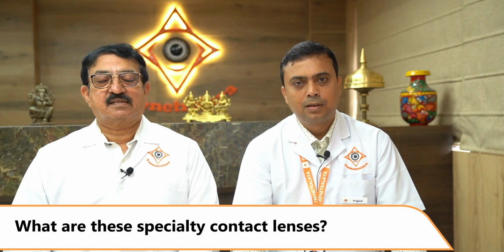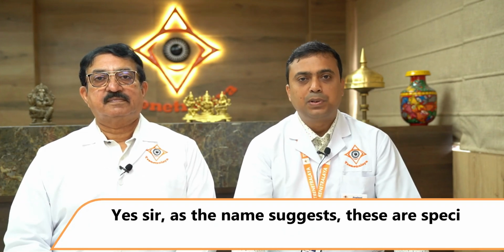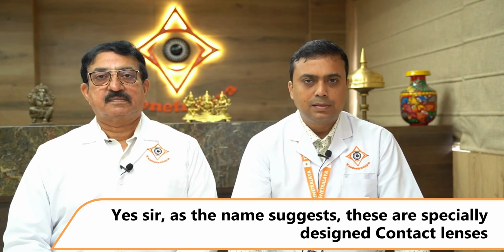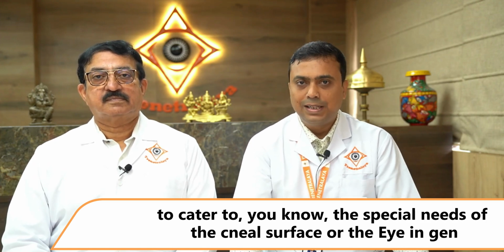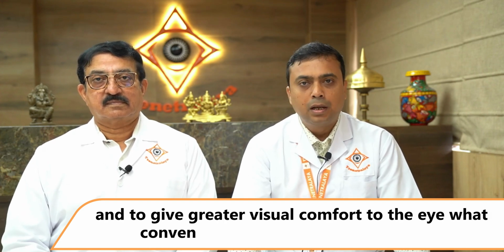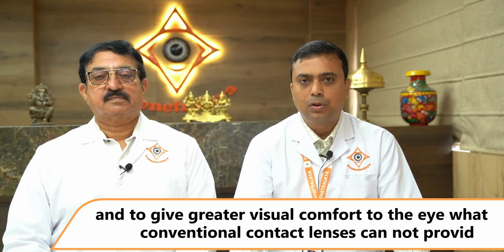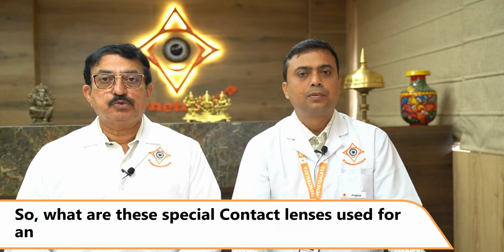So Prajjwal, I'd like to know, what are these specialty contact lenses? Yes, sir. As the name suggests, these are specially designed contact lenses to cater to some specific needs of the corneal surface of the eye in general, and to give a greater visual comfort to the eye, what conventional contact lenses cannot provide.